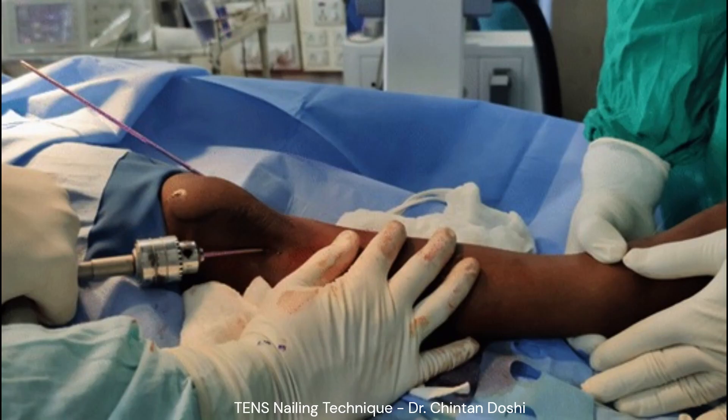The second nail is then entered into the reduced fragment. While inserting the second nail, it is important to avoid the snaking effect. This is prevented by not allowing the second nail to completely rotate over the first nail.